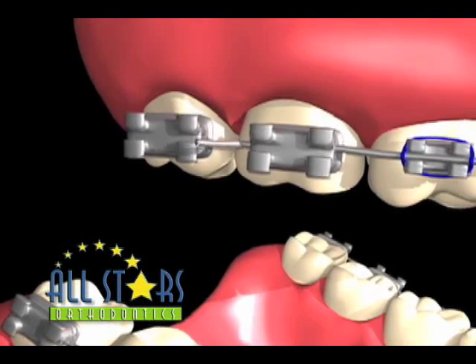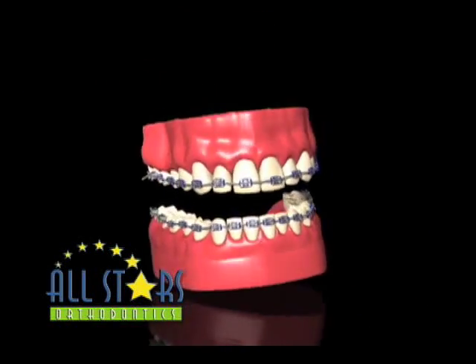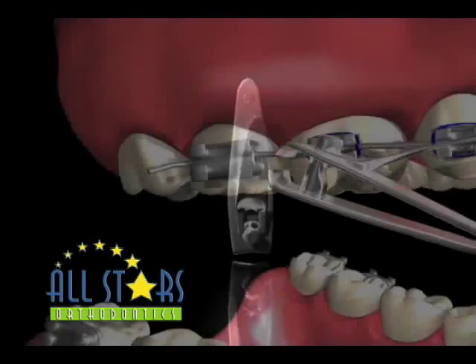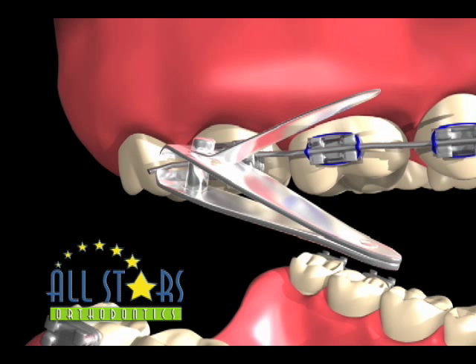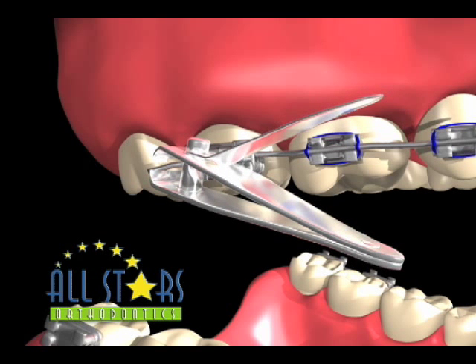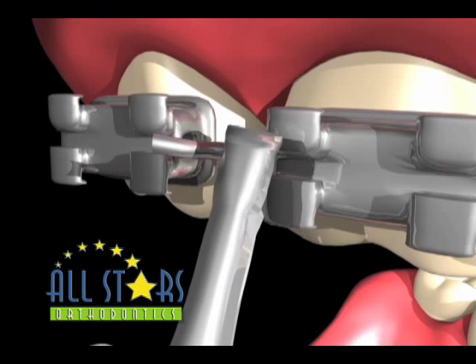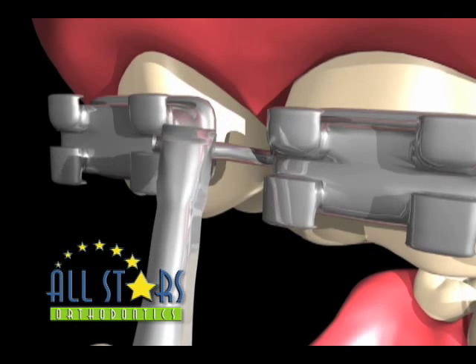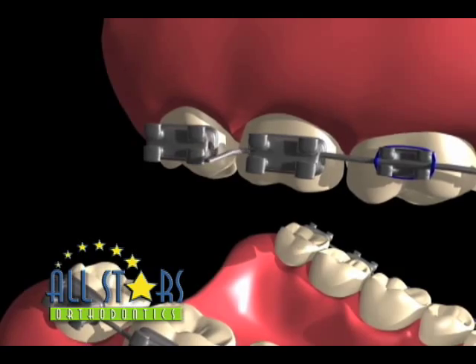Sometimes the last brace has been knocked off and you're left with a long poking wire that has no brace to be placed back into. This is solved with a pair of household fingernail clippers. Simply slide the clippers along the long wire until you reach the back of the last brace that is glued to your teeth. With a firm squeeze, the extra portion of the wire will be cut off. This solution can also be used if you're unable to slide a long wire back into that last brace, or if the wire is too short to slide into the last brace.